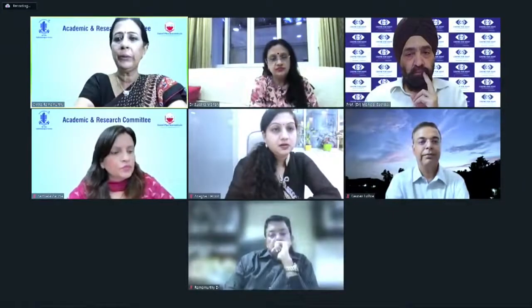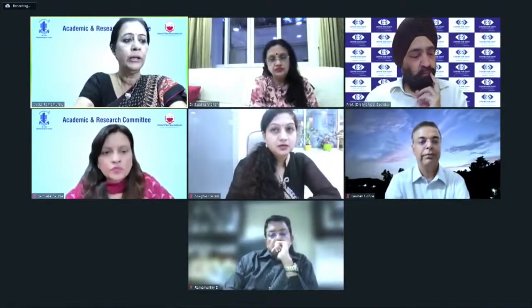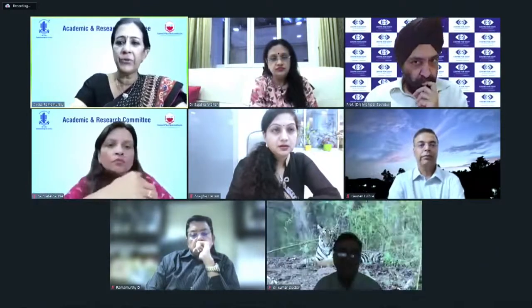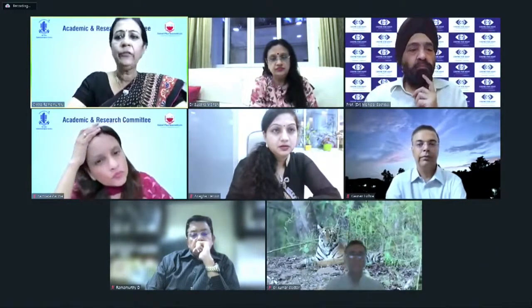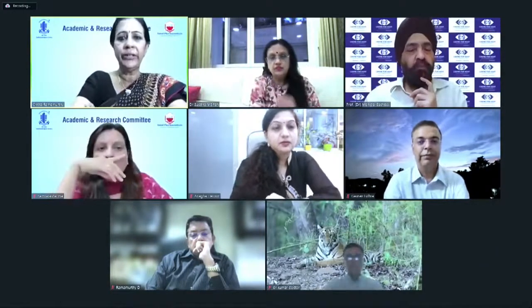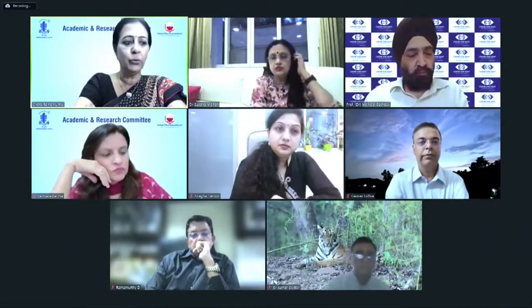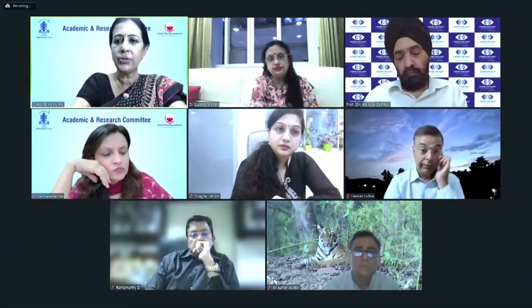Dr. Mahipal, I would ask, would you have thought of trying a PTK for flap striae? And if we were to do a PTK, theoretically, how would we titrate the amount of epithelium removal? Would we take ASOCT guidance?